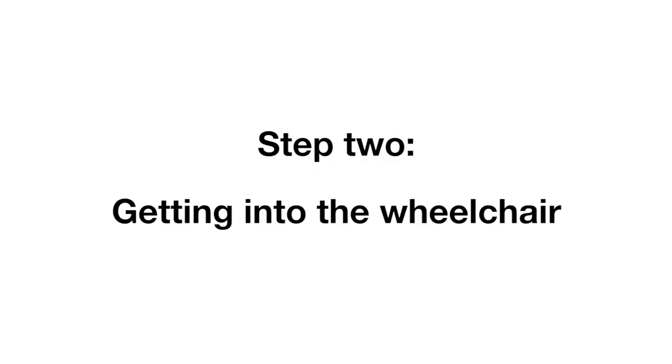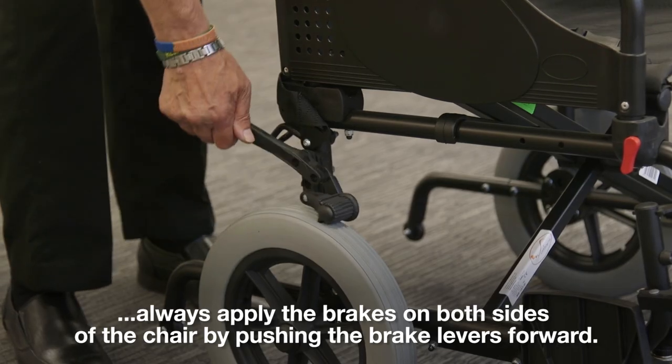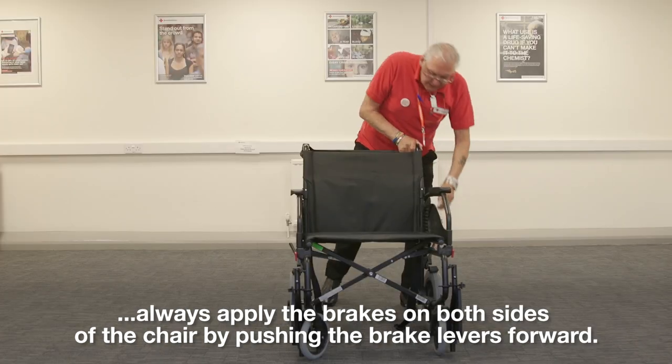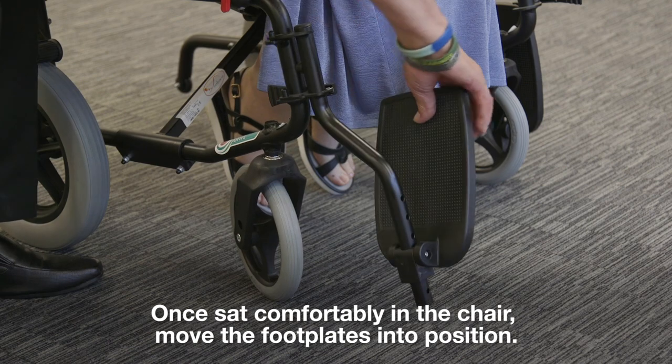Step 2: Getting into the wheelchair. Before sitting in the wheelchair, always apply the brakes on both sides of the chair by pushing the brake levers forward. Once sat comfortably in the chair, move the footplates into position.